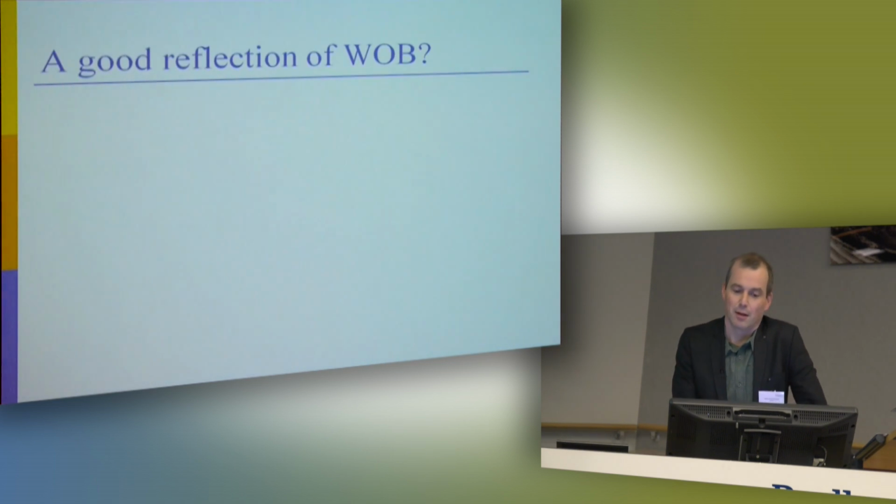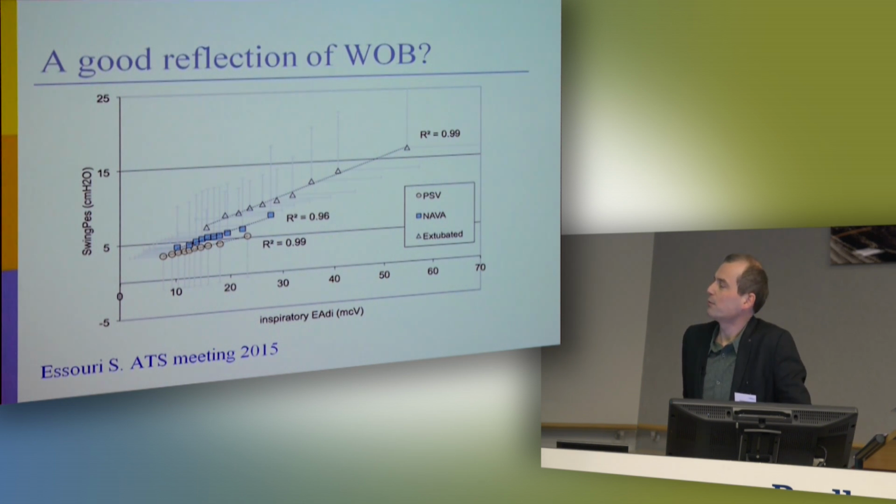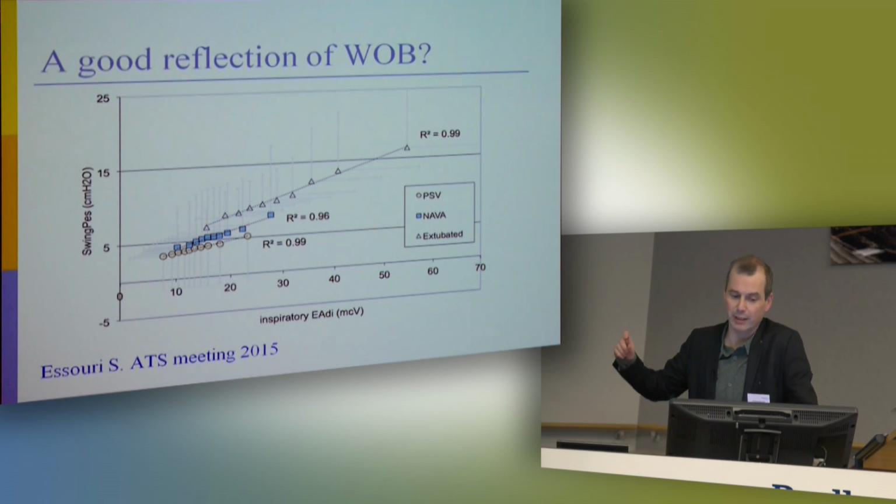Is EAdi a good reflection of the work of breathing? This is a complex question, and we tried to address it with Sandrine Essouri last year. She completed a study in our unit where we tried to evaluate the correlation of the inspiratory EAdi with the swing of esophageal pressure, to see if it's a good indicator of the work of breathing.